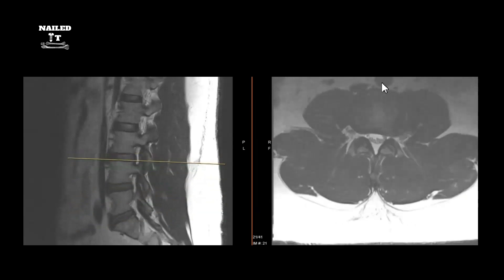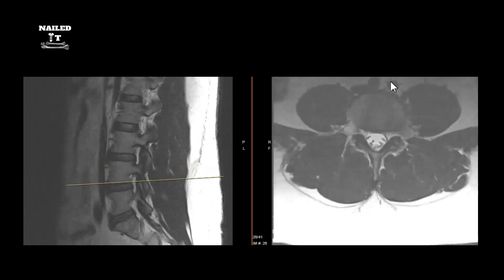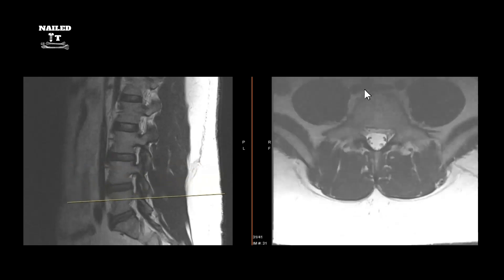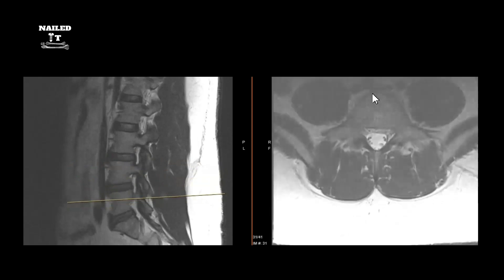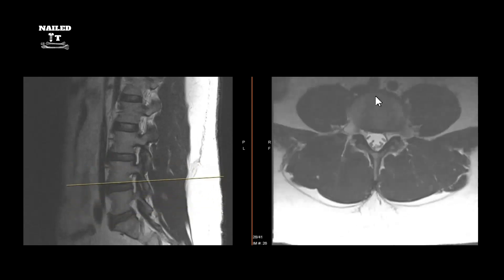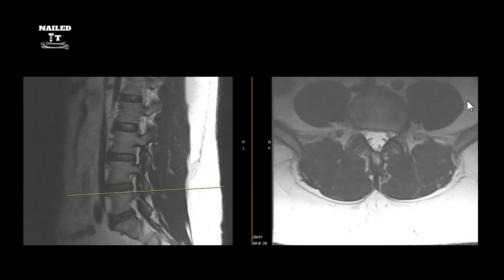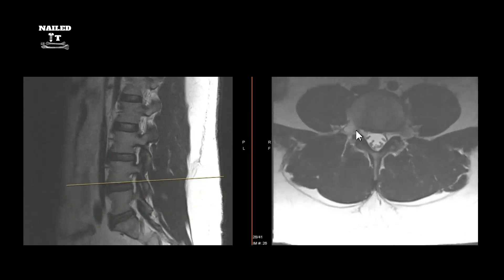Anteriorly you have the aorta and inferior vena cava — you can watch them split as you scroll down. The aorta typically splits around L4-5, and the vena cava tends to split around the L5 vertebral body. Always pay attention to your vasculature — it matters depending on what kind of approach you're doing, especially for lateral or anterior approaches.